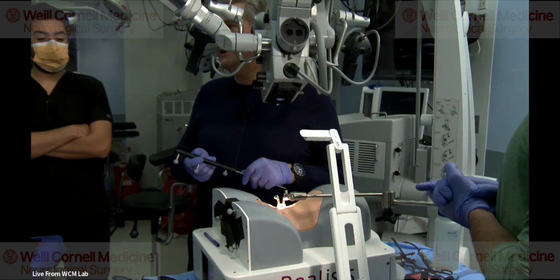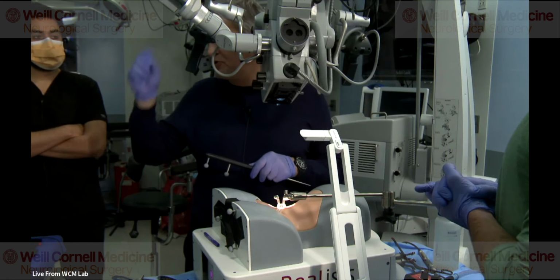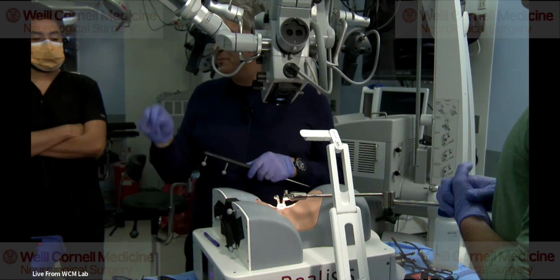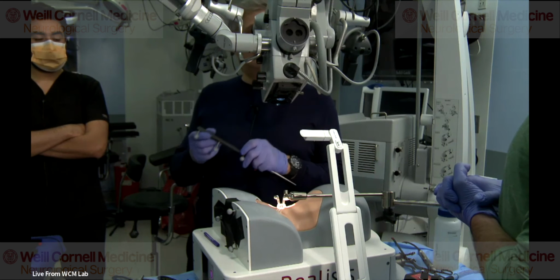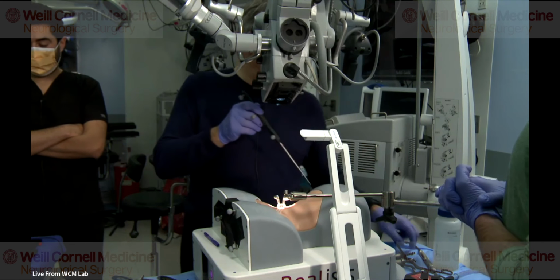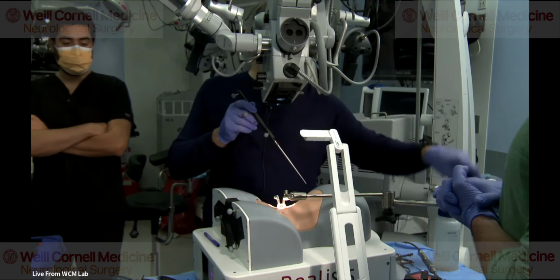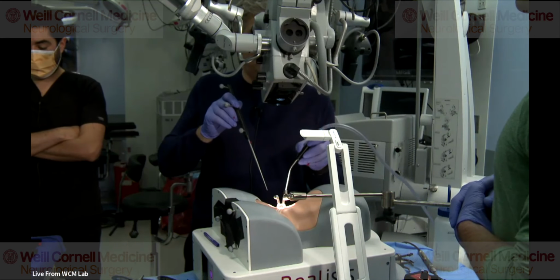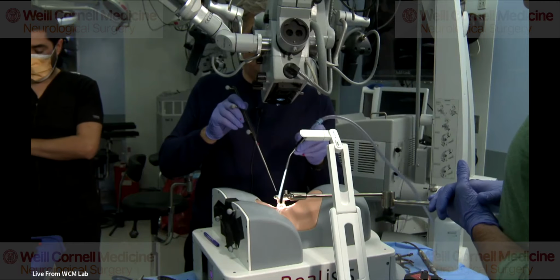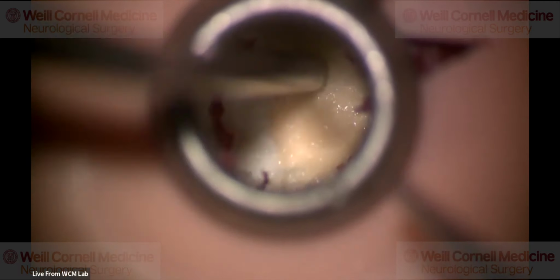Then you can see the whole trajectory through the muscle under the microscope down to the bone, and then you drop your first dilator under direct visualization. That's my main advice for bleeding control. And then also at the end, when you take it out, you do the same thing. You bipolar on your way out.